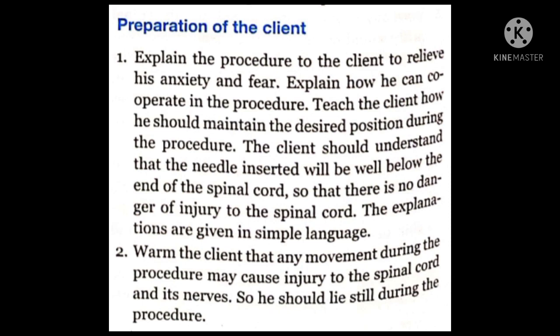The client should understand that the needle inserted will be well below the end of the spinal cord, so that there is no danger of injury to the spinal cord. The explanations are given in simple language. 2. Warn the client that any movement during the procedure may cause injury to the spinal cord and its nerves, so he should lie still during the procedure.